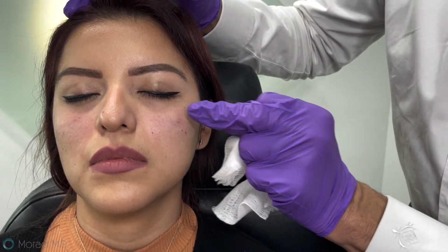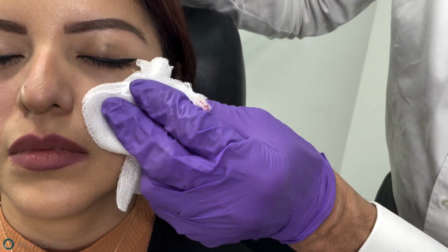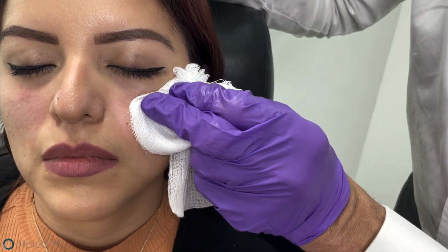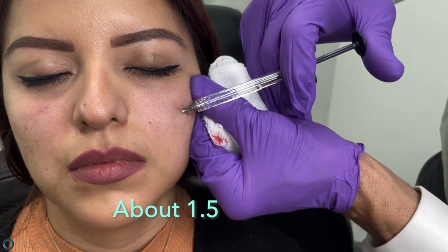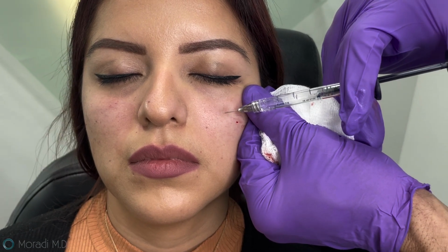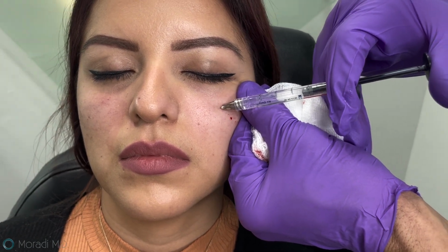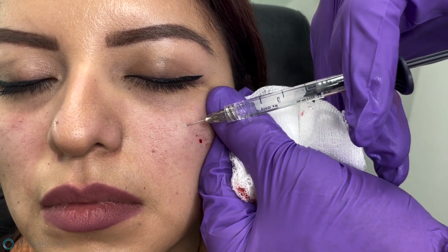So objective is, again, what I think about is malar eminence. I want to make sure from here to here I can connect the 2 points in a smooth transition, but not a dip. We had approximated that we would be using about 1.5 cc per side, and in practice it seems like that's exactly what's happening. That 3 cc's are what we need. Slow injections because there is a lot of vascular tissue in this area.